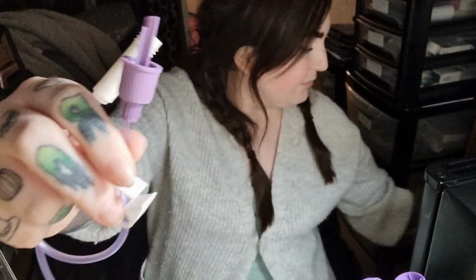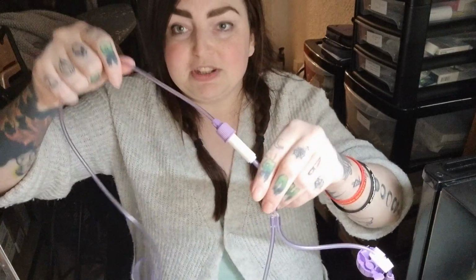Right. So what I do is, this has got 2 little dangly bits here. So you take the little ends off the little stabbers. These are the little stabbers, see? And you chuck them in the bin. So you put that on one of them, and you take the other stabber, stab it right through so that it pierces the film inside. So then you've got the 2 connected. And then you take this tube, you take the little bit off the stabber of this tube. There's lots of stabbers involved. And then you put it in here and twist it on. Nice. There we go. So that's it all connected to all its tubing.